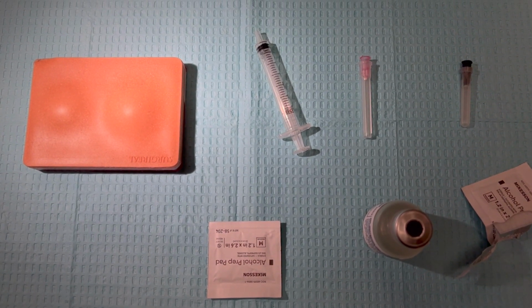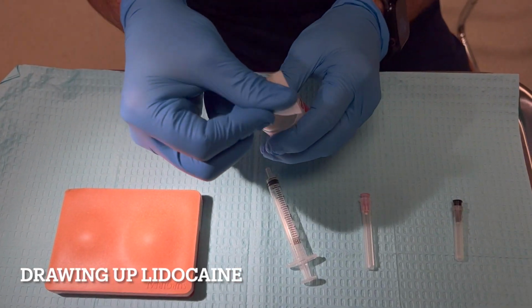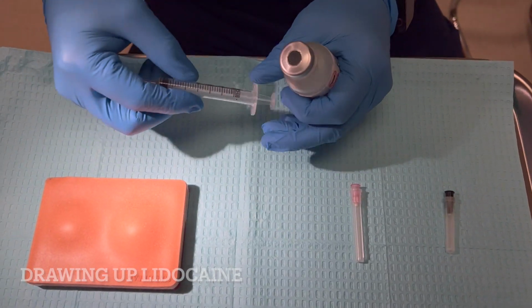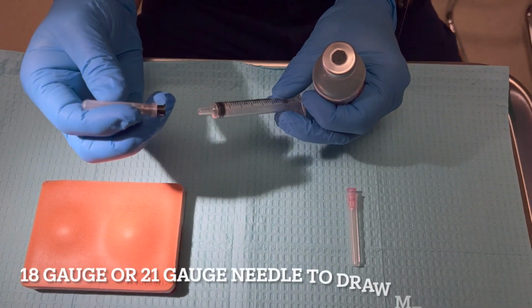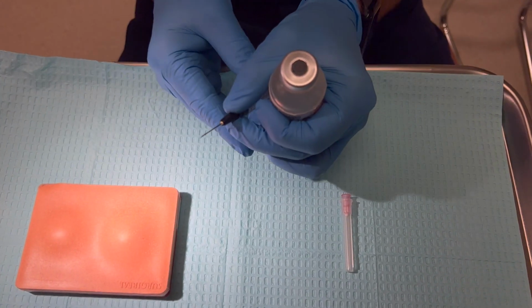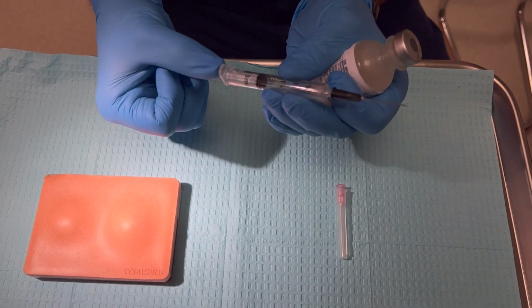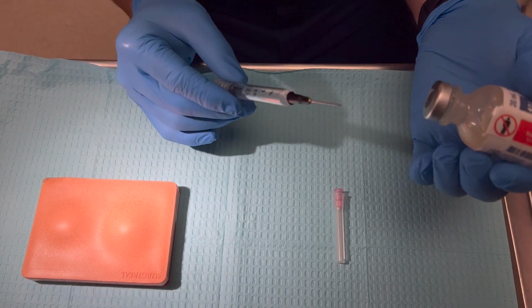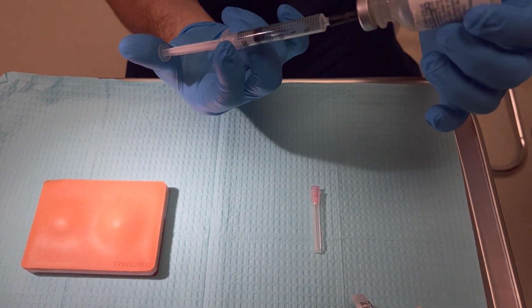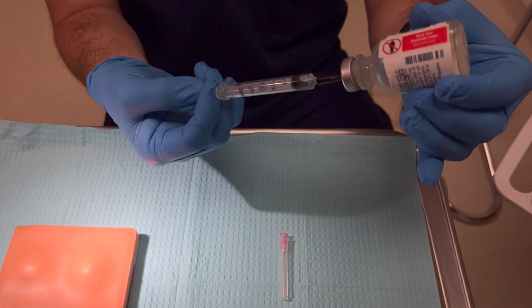from that vasoconstriction. To draw up our medication, because this vial can be reused, we're going to first use an alcohol pad. We want this to be dry before we insert the needle. We're going to use a larger bore needle in order to draw that medication up. Frequently, I will pull back on the syringe, invert the vial, and insert air into it, and that allows for an easier drawback of the medication.